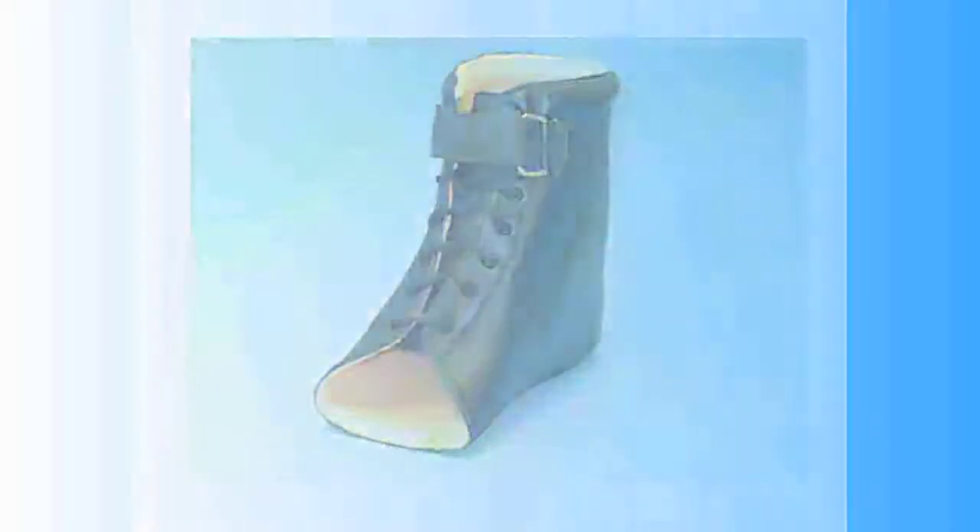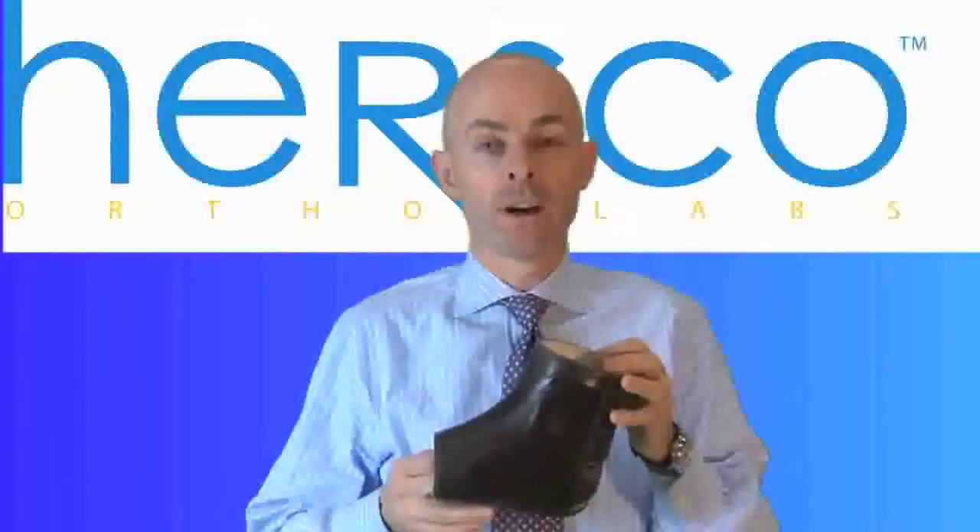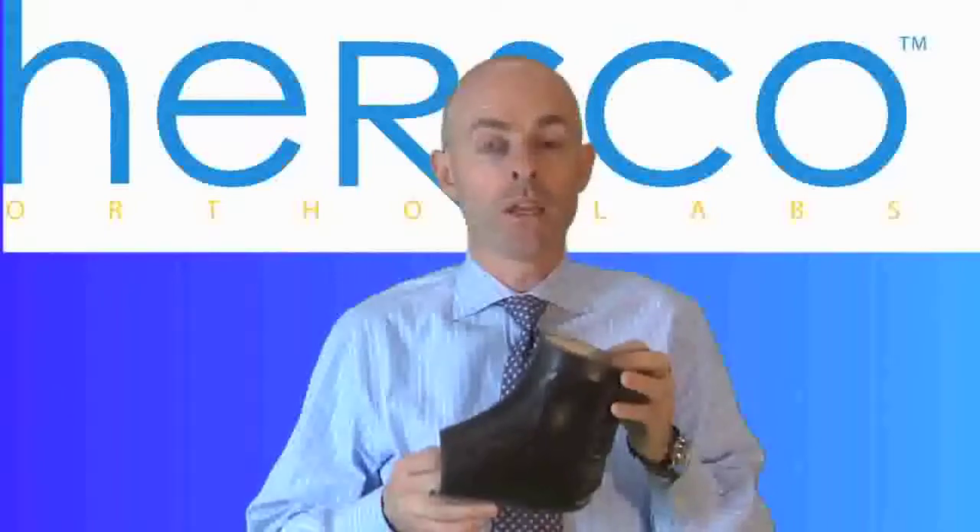You can also use a plastazote lining. However, it does add to the bulk of the device, and that's always a consideration for any AFO.